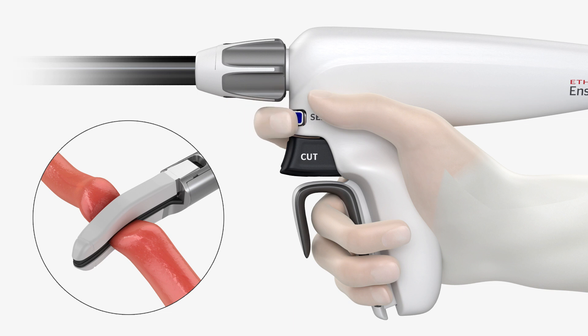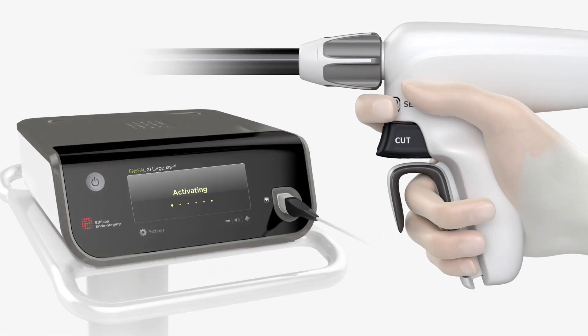Press the blue seal button or min foot pedal to energize the jaws and begin coagulation of the targeted tissue. The generator gives audible feedback as energy is delivered to the clamped tissue. Continue to depress the blue seal button or min foot pedal until the activation cycle is complete and a second tone is heard, indicating energy has been stopped. Release the seal button.